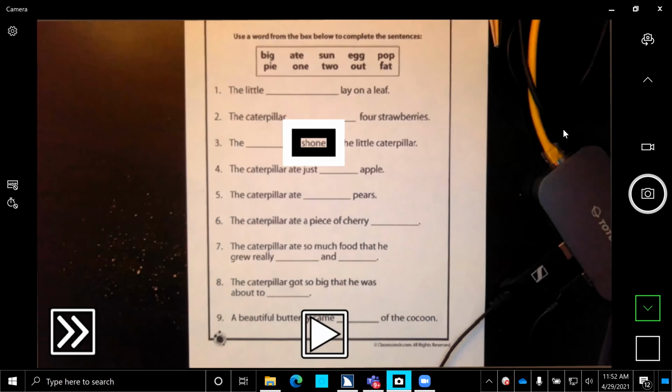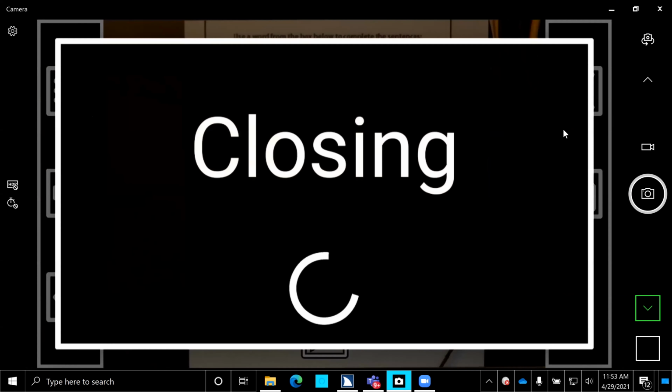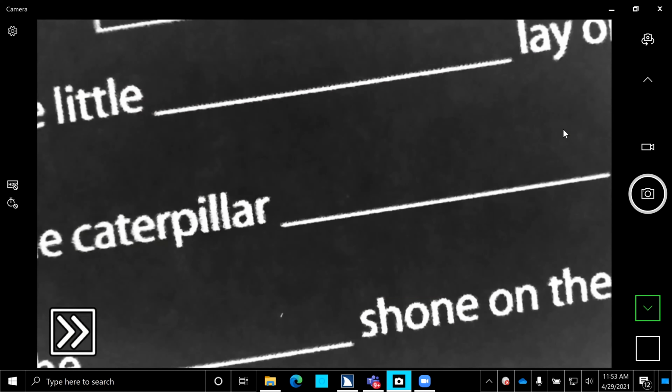So you have the ability to save. Justine, do you remember how many documents we can save? It has 4 gigabytes of storage, so you can save about 600 files, 600 images. And you can provide audio tags. So now if I go back, I'll close out of this. My document's closed. I can now open up the file manager.